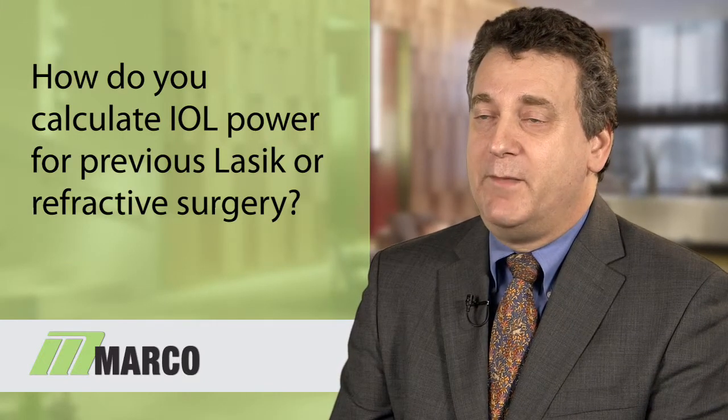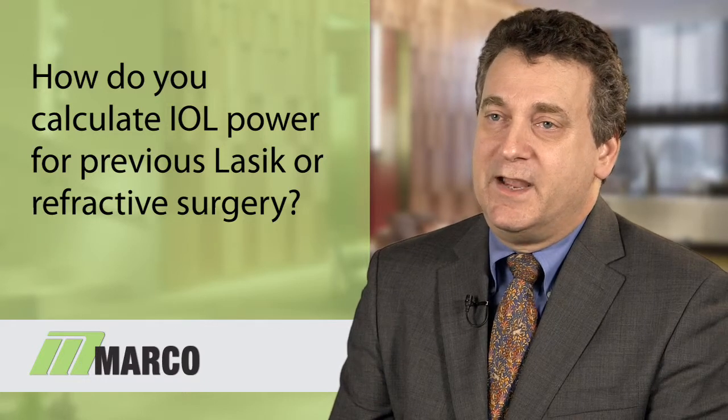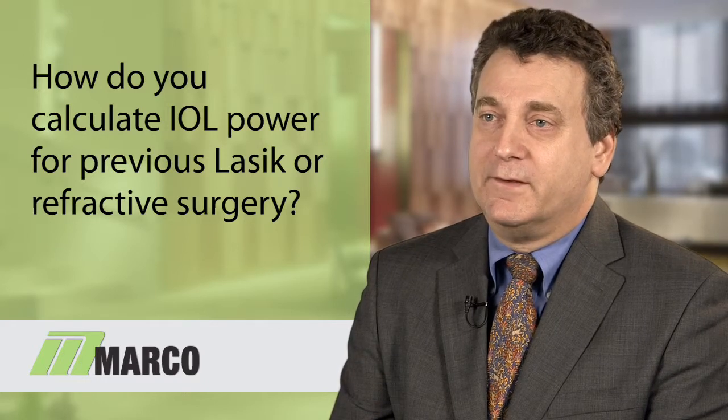And when you take their cataract out, that corneal astigmatism will then become manifest. So many of these patients actually do become good candidates for a toric implant at the time of their cataract surgery. And again, without the data that you get from the OPD scan, being able to manage these patients would really be very, very challenging, and instead it's made it almost a routine event in our office.